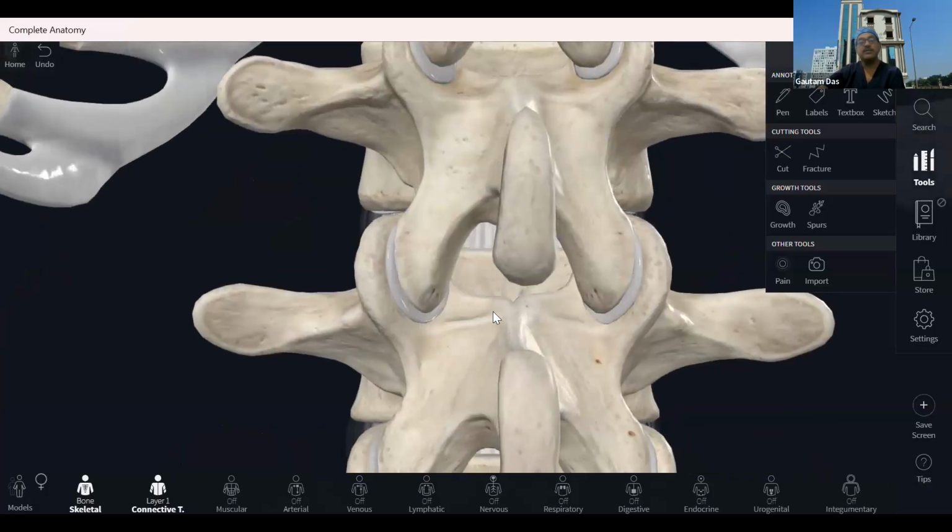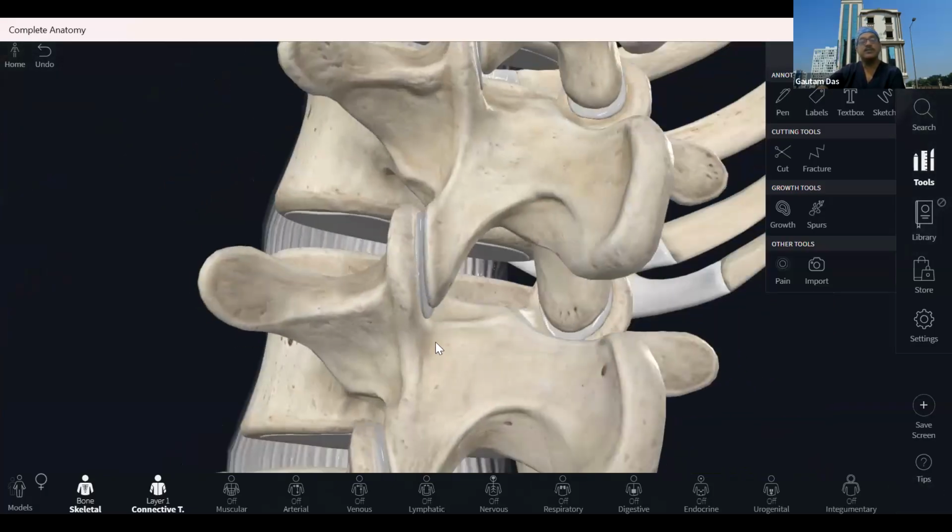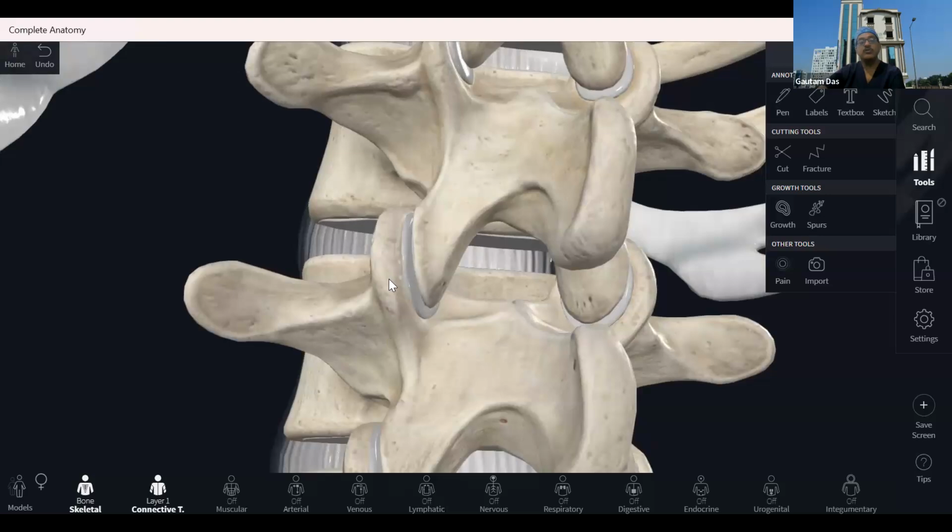Then when we slide the probe more medially, this area of the bone is most projected. I'm just magnifying it. You see, this is the superior process. In this superior process, the most lateral part is known as the mammillary process, and this projection is known as the accessory process. There is a ligament, the mammillo-accessory ligament, below which the medial branch basically passes in this way.